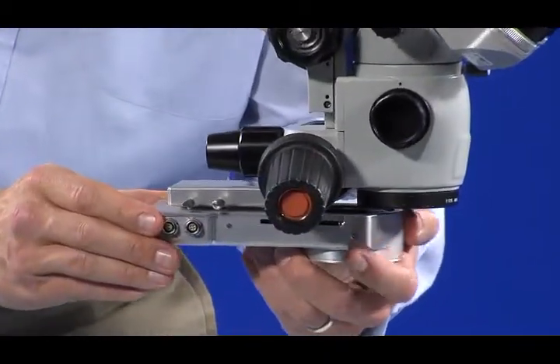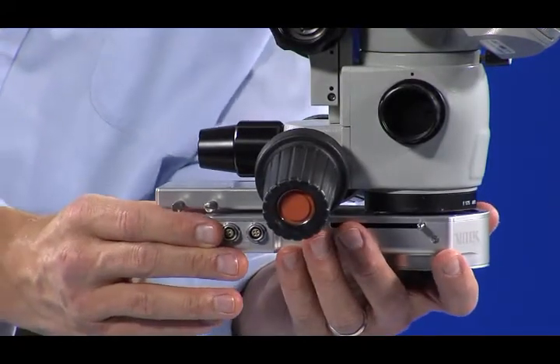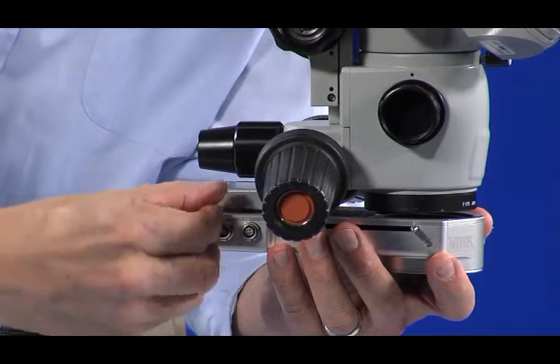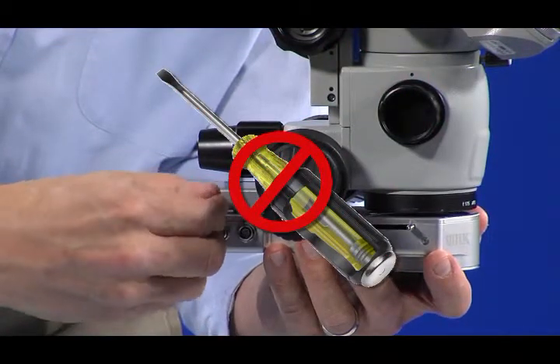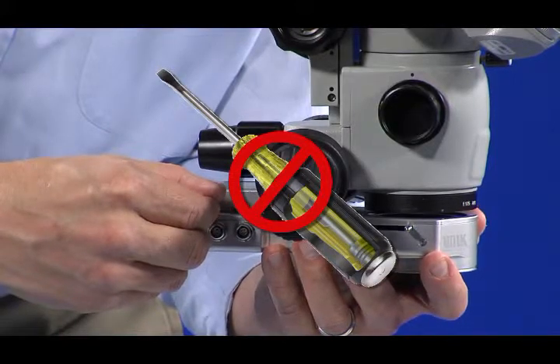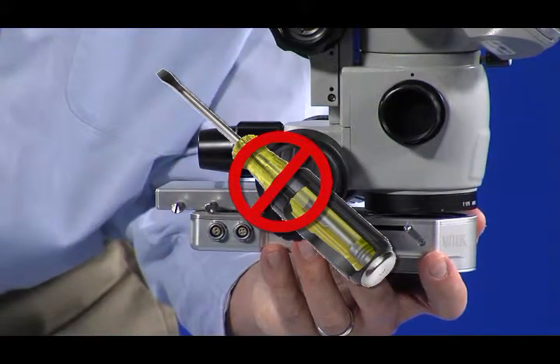Slide the dovetail on the CLA into the adapter plate installed on the microscope. Then, tighten the thumb screws to secure the CLA in place. Warning: do not use a screwdriver to tighten the thumb screws. A screwdriver places excessive force on the thumb screw and may break it off.